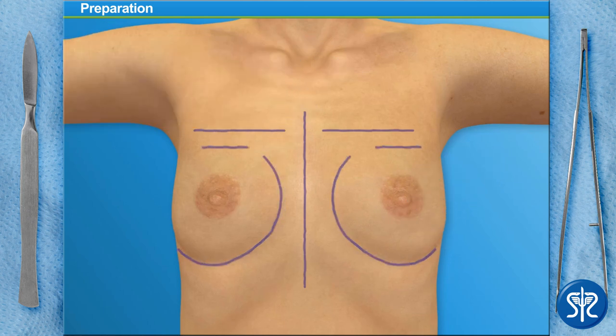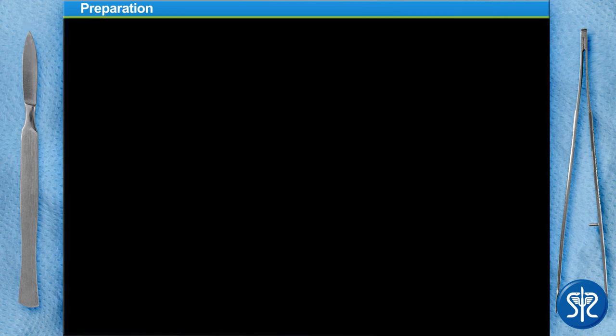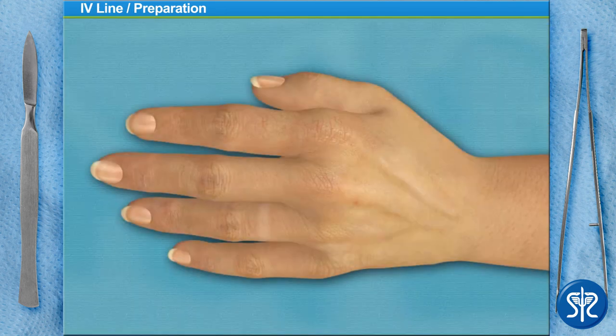On some patients, the creases below the breast are not at the same level. If this is the case, we would make our incisions at different levels to ensure the breasts are even after surgery. However, this is not the case with this patient. To begin the surgery, we need to start an IV to provide our patient with fluids and medication.